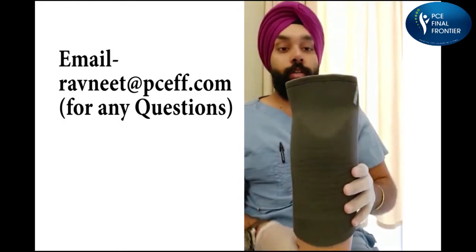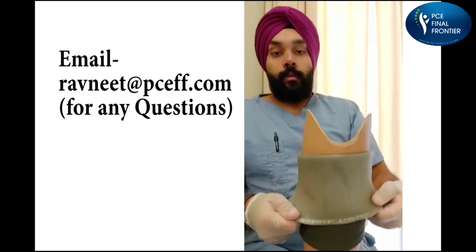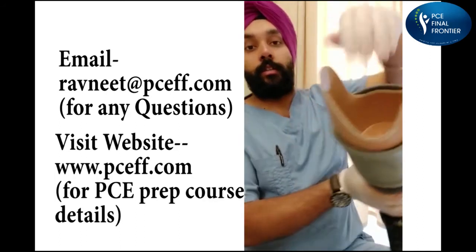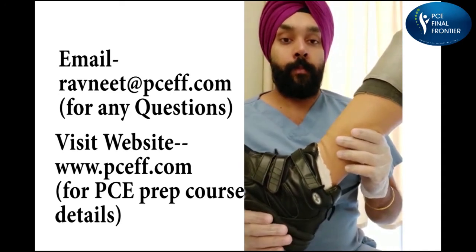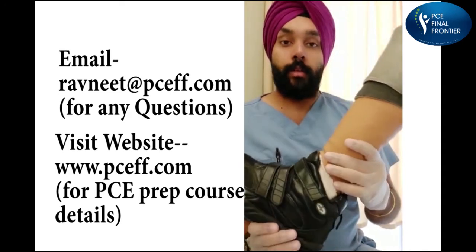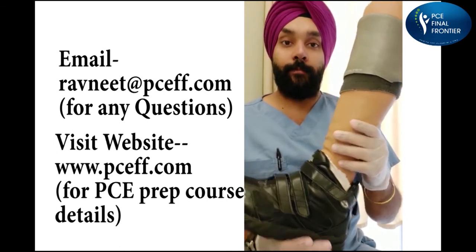Suspension, socket, the socket and the stump goes in there, and it's an exoskeletal transtibial prosthesis. All right, great.